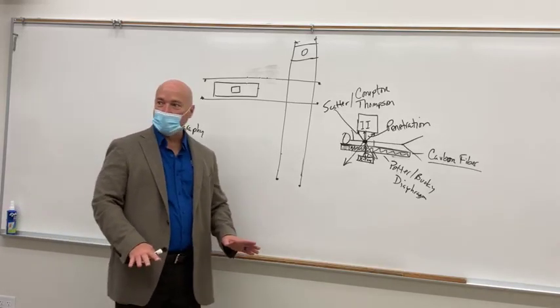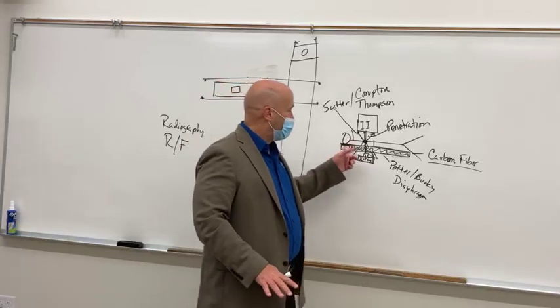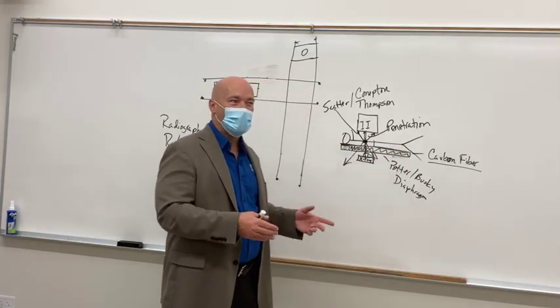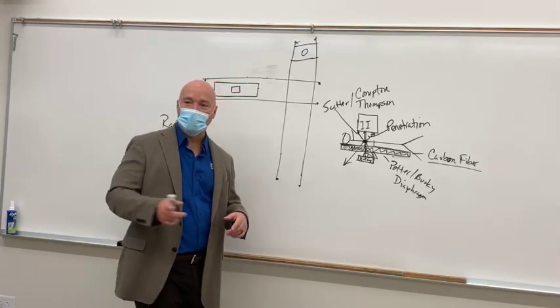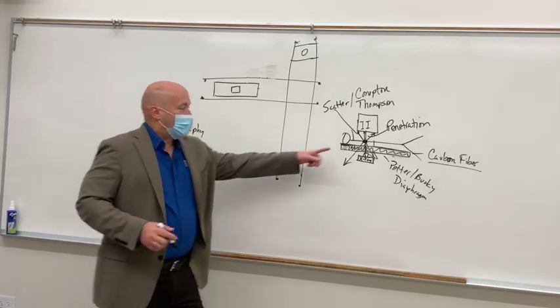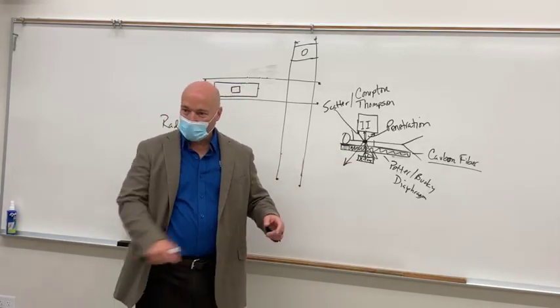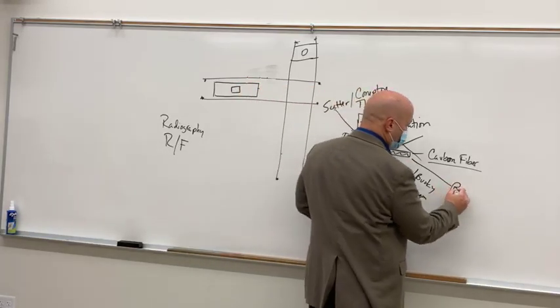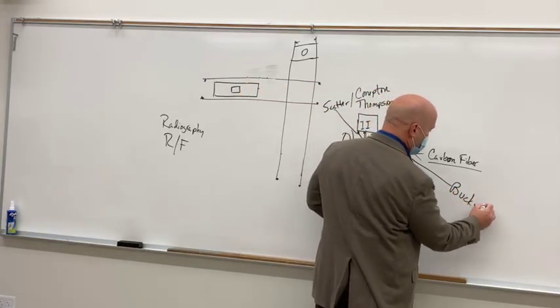It's your gonads, right? So your dose coming through that bucky slot can be relatively high to a portion of your body you don't want exposed to high levels of dose, right? So that thing that drags with the bucky whenever you move is what we call a bucky slot cover.